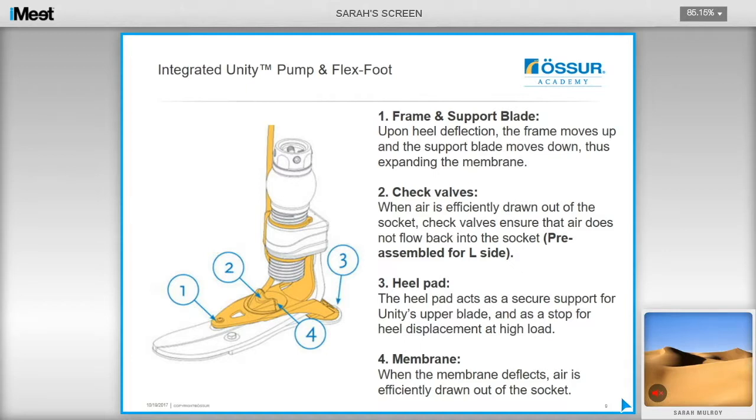The Unity system consists of a pump mechanism that utilizes the movement of the foot to draw air from the socket. Upon heel deflection, the frame moves up and the support blade moves down, expanding the membrane housed within the pump. When air is drawn out of the socket, check valves ensure that air does not flow back in. The heel pad acts as secure support for the Unity upper blade, and when the membrane deflects, air is efficiently drawn out of the socket.